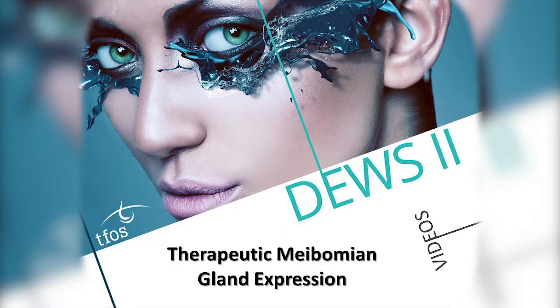Patients with meibomian gland dysfunction can achieve some relief from symptoms if the blocked oils are cleared from within the glands. Forced emptying of the glands is termed therapeutic meibomian gland expression and can be undertaken in office by the eye care professional.